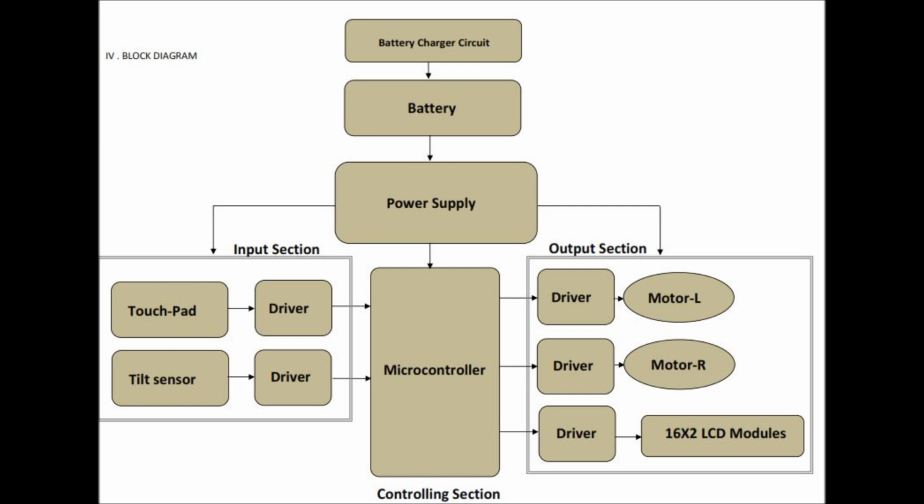Finally, power supply. Power supply is the heart of the circuit to run efficiently. We have designed a 5 volt and 1 amp DC regulated supply for the circuit, because we used ICs and microcontrollers which belong to the TTL family. My friend Gayatri will proceed to the head movement sensor.